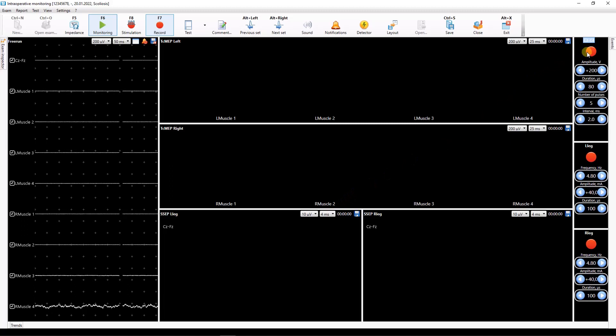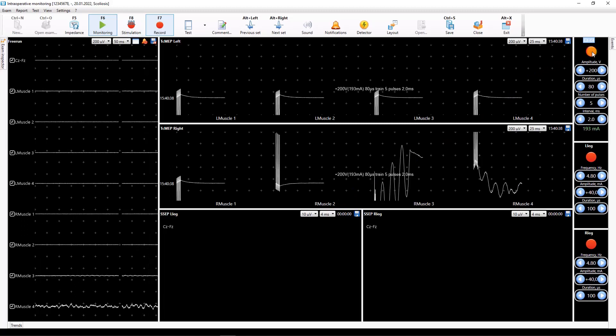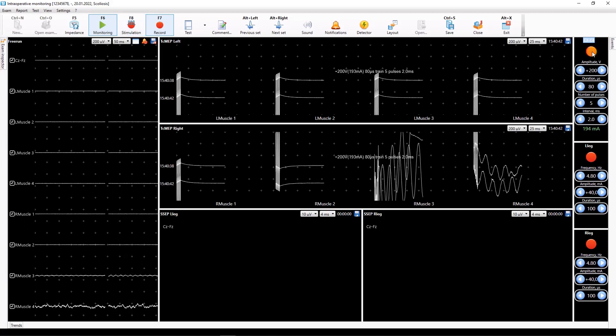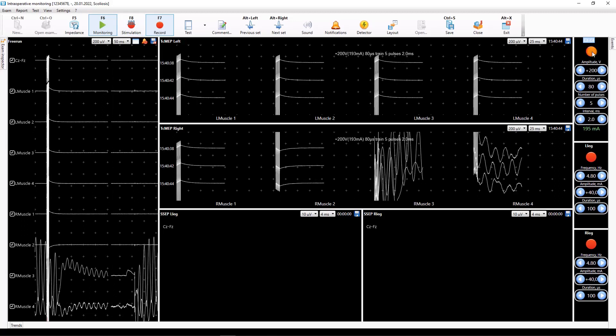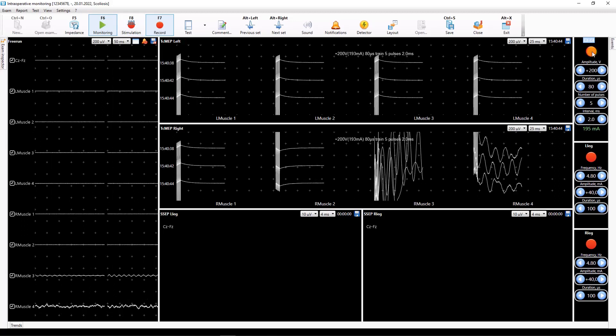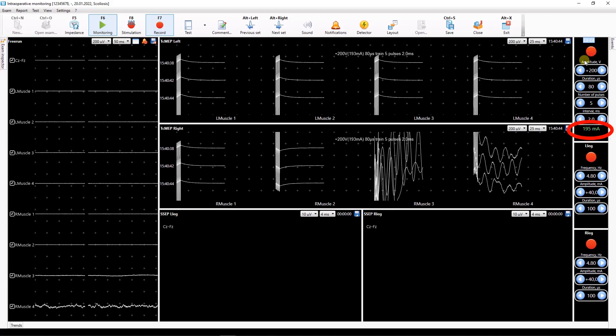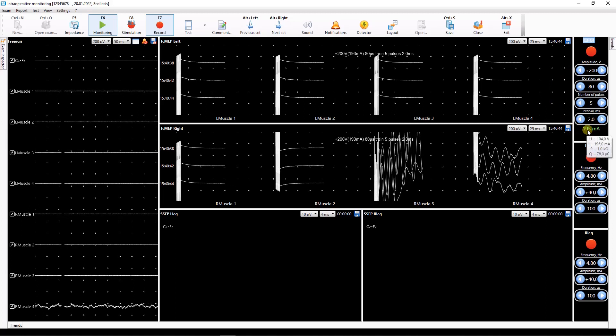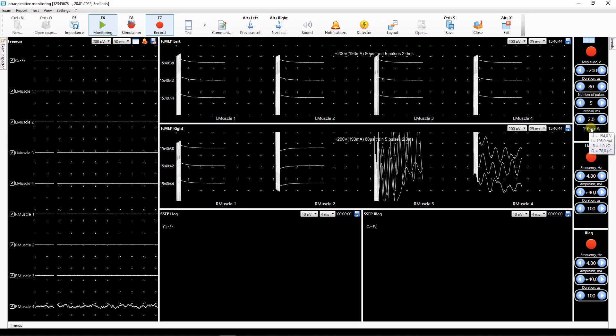To start stimulation press red button in the corresponding stimulator window. In the stimulator window the measured current value will be displayed in green. If you point the mouse cursor to the green inscription additional stimulus data will appear. For example stimulation voltage, impedance and charge.